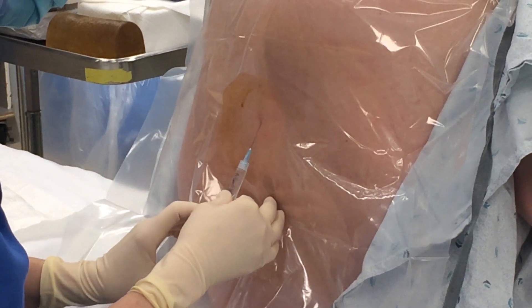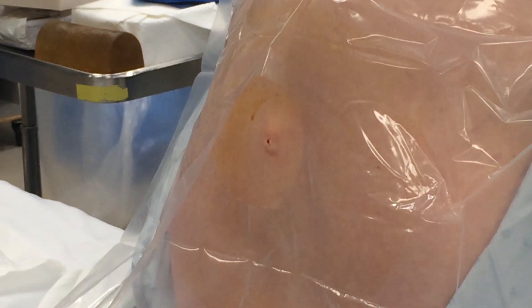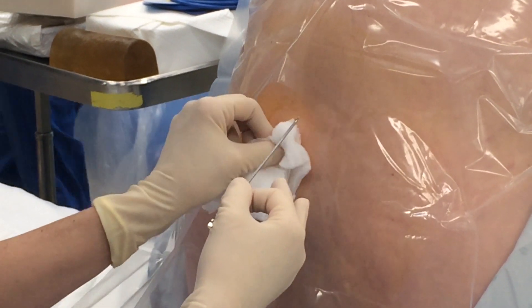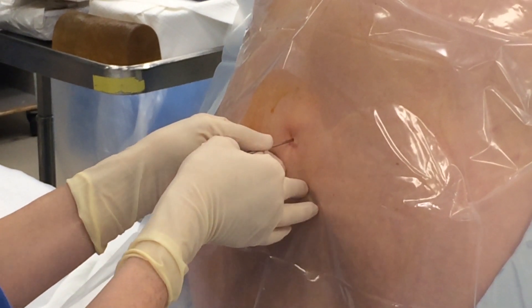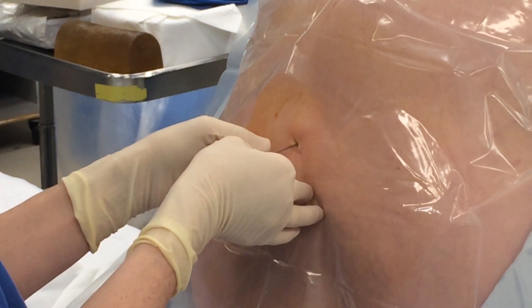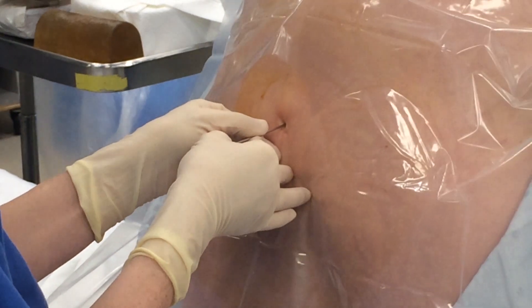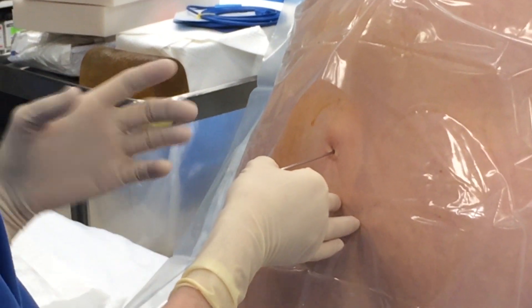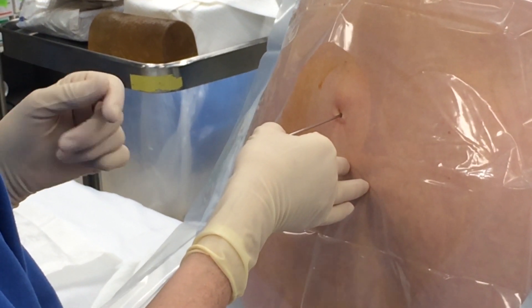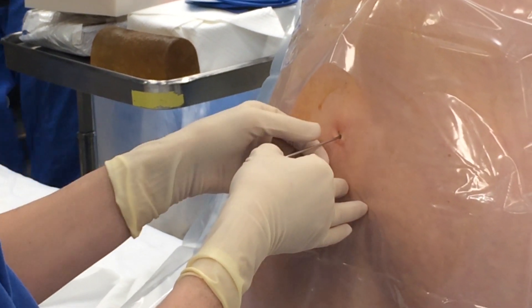The skin is infiltrated with lidocaine in the usual fashion. With sterile prepping and sterile draping in place, you work on accessing CSF with the needle. Almost always the L4-5 interspace is used. This is not like neuraxial anesthesia where you want to match the height of surgery to the level at which you access the epidural space, and it would very rarely be appropriate to place a needle at a level where there was actually spinal cord. So typically we use L4-5.